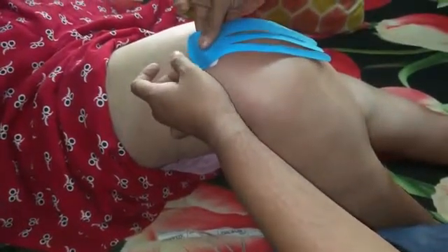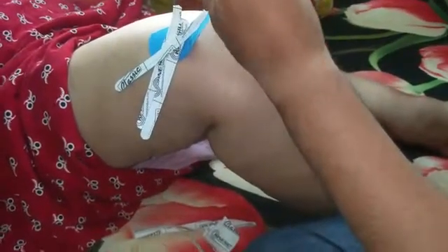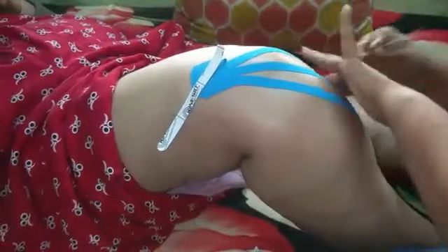We just remove the tape backing. Try not to touch the surface where we are sticking the tape — just tear it off. Get a firm base anchor, and the area which needs to be drained uses what are called the fingers of the tape. These are aligned to drain the swelling of the knee joint.